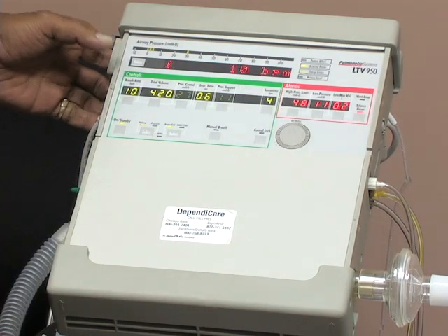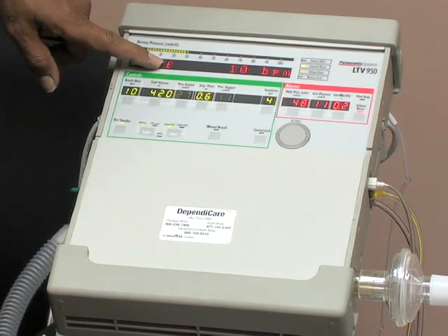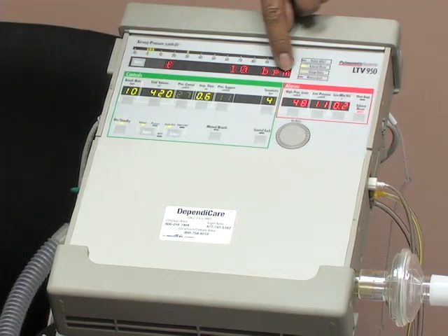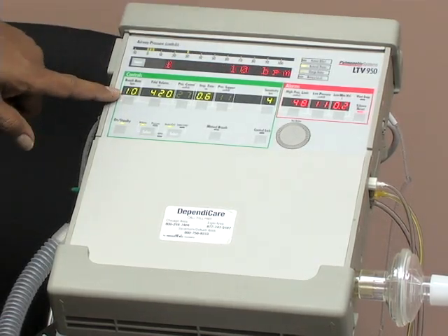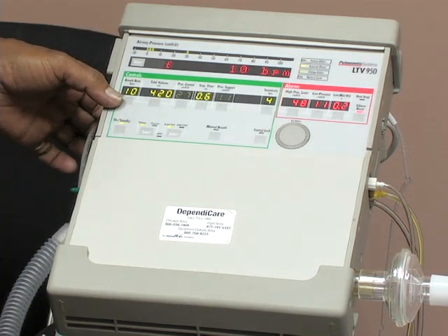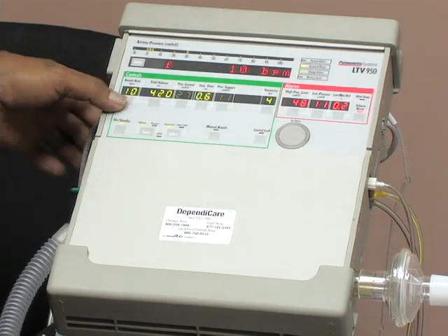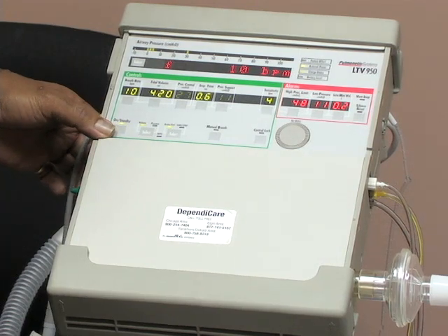Okay, now let's look at our breath rate. It's notated as F on your reading screen, but it represents the breaths per minute. As you can see right now, it's breathing at 10, as we have it set at 10. Sometimes your patient may breathe above this, so your setting may be 10, but he's actually doing 12 or 13. This is actually a good sign.